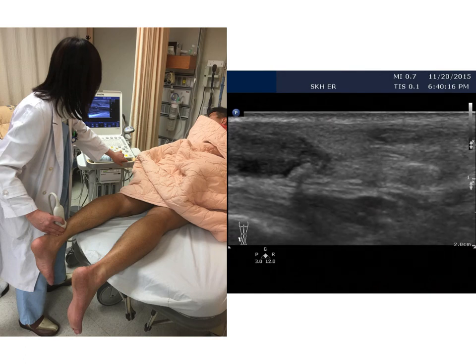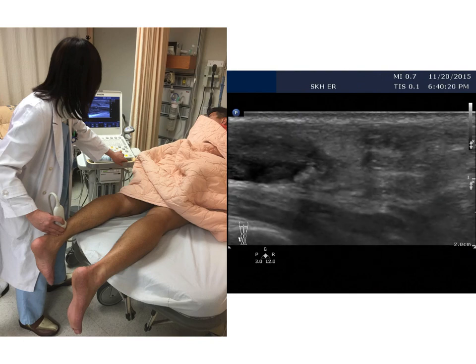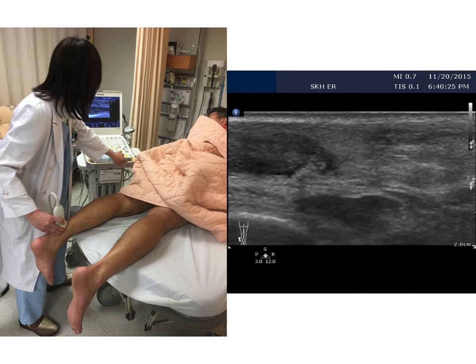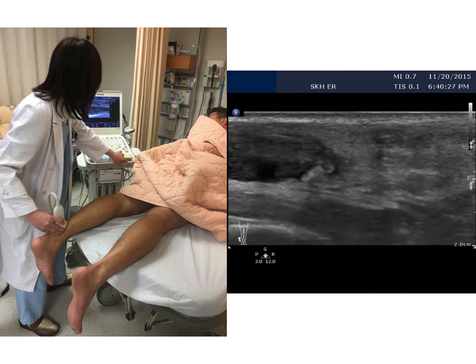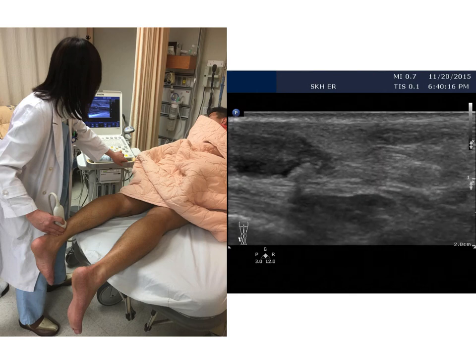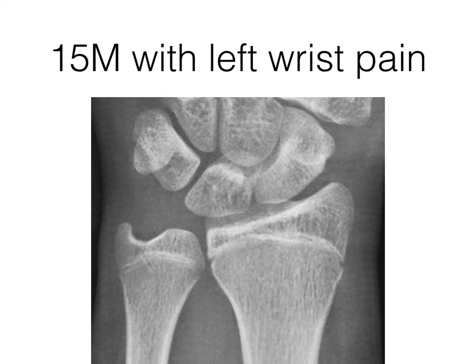Here, we use ultrasound because you can use it to test dynamic status, just like this one. The distal end, the proximal end of the Achilles tendon, the disruption and the hematoma here. You can do it in a dynamic way to test musculoskeletal systems.